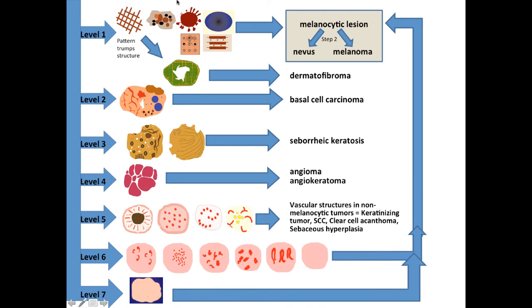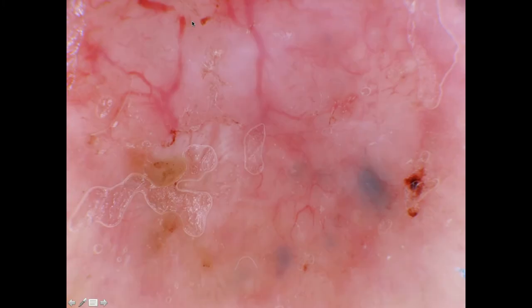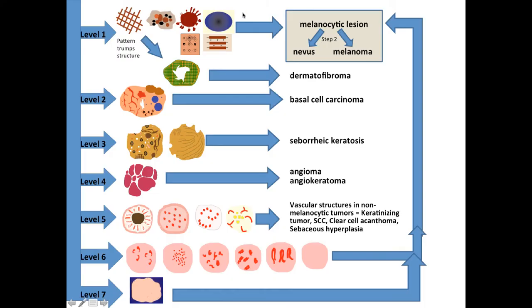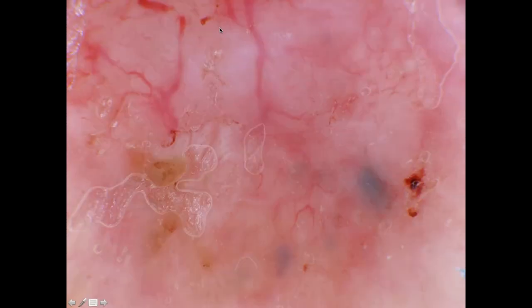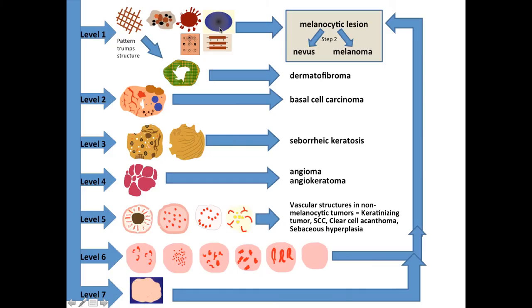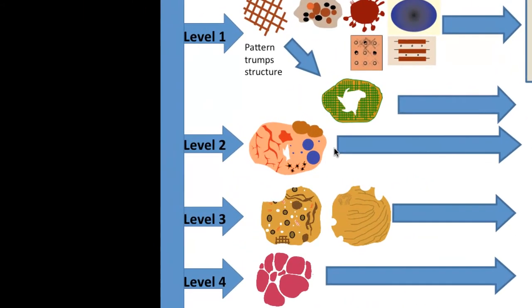First question: is this a melanocytic lesion? Do we see pigment network anywhere? No. Do we see aggregated globules? No. Do we see streaks at the periphery? No. Do we see a homogeneous blue area like in a blue nevus? No. Since none of those criteria are found, we move on to level two.